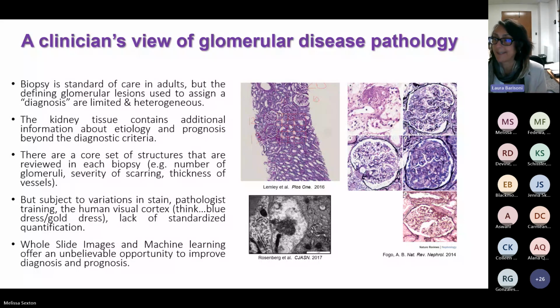When we study these elements using visual assessment, there is a certain lack of standardization or lack of reproducibility because visual assessment is subjective. And pathologists are really good at interpreting data, but in reality, they're not good at quantifying data because, again, it's difficult to count. It's difficult to measure the size of things with the human eye, right?